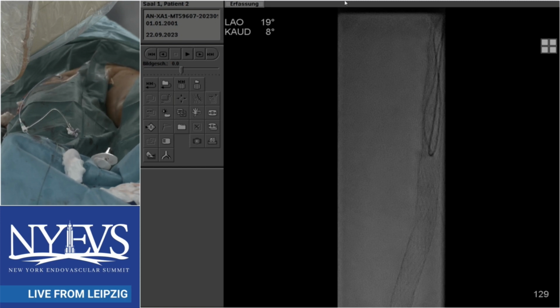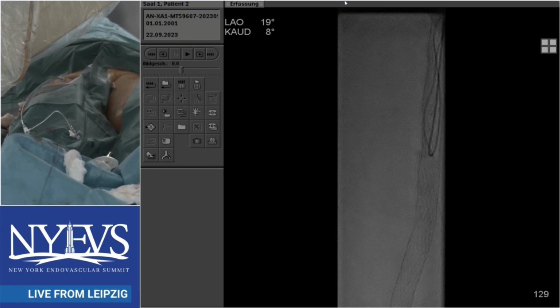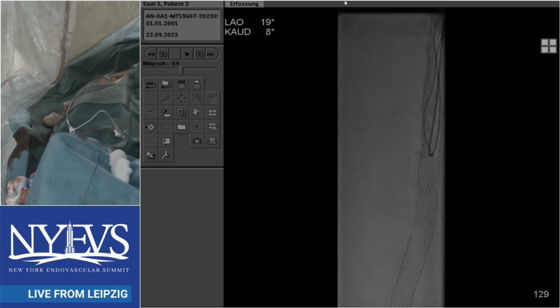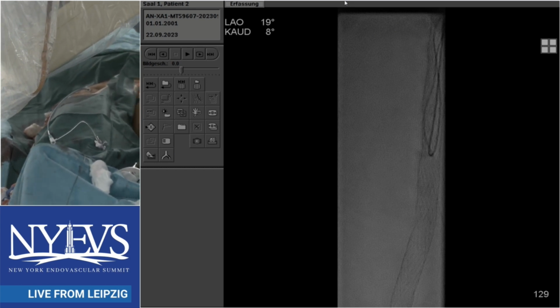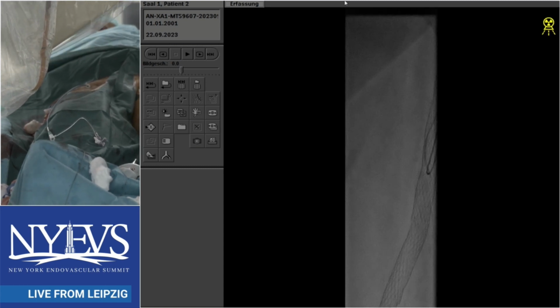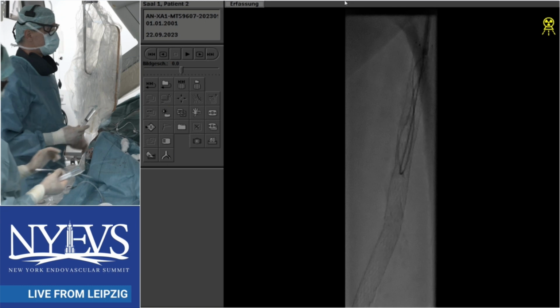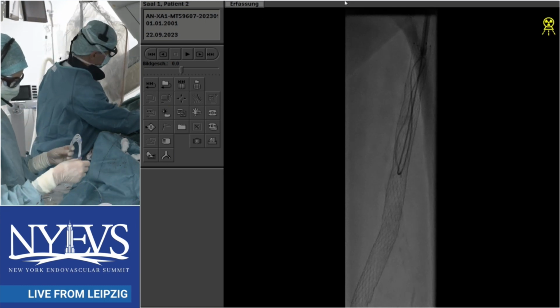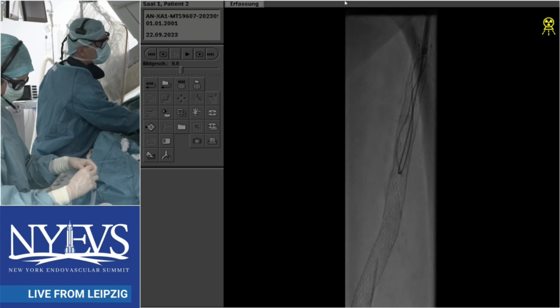Yeah, that's a great algorithm, and I think most of us, if you think of RCTs, there are RCTs for DCB, laser, covered stent, etc. Obviously, the numbers are small even in those trials. How many people would use a filter in this case? Obviously, when we're dealing with ISR in the periphery, we've got big vessels. We're dealing with not only intimal hyperplasia, but thrombus of differing ages, debris, and so forth. So it looks like everybody would use a filter in this case. Would anybody approach this case any differently? Yes. How would you do this, Christian?